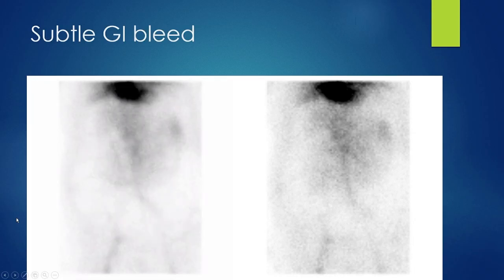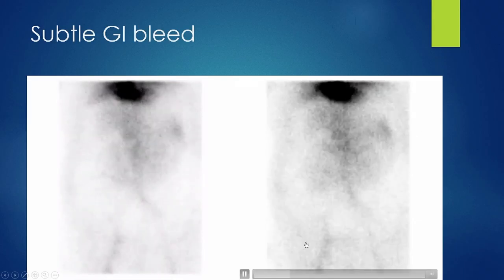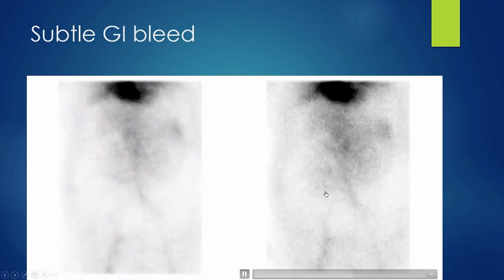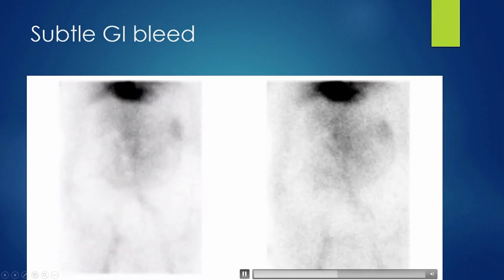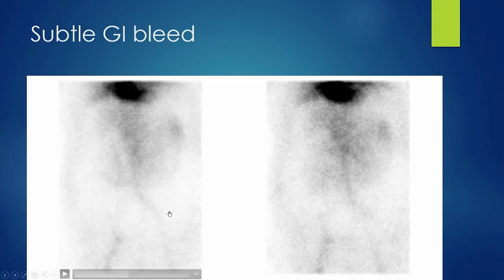Here is a subtle GI bleed — having a baseline flow image is useful, and careful tracking of activity is important. There is subtly increased uptake in a specific area over the first 60 minutes and into an additional 30 minutes. Another notable finding is a large photopenic area — ascites — with mild haze in the middle because bowel is squished together by the ascites. In cirrhotic patients, it can be much more difficult to localize bleeding.